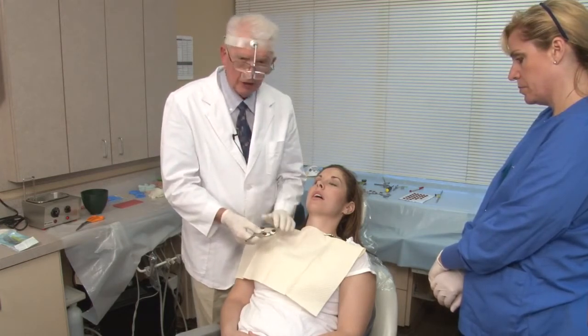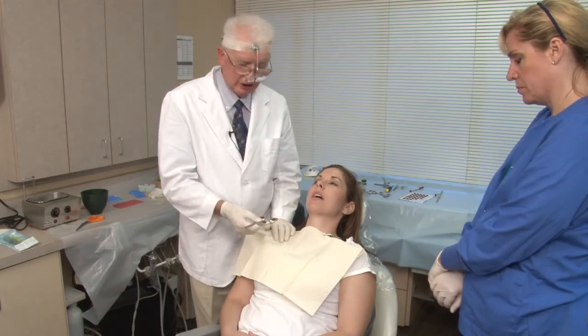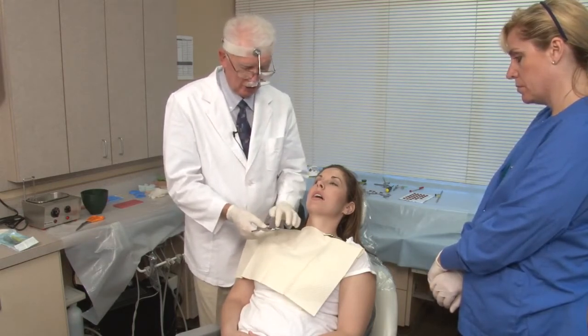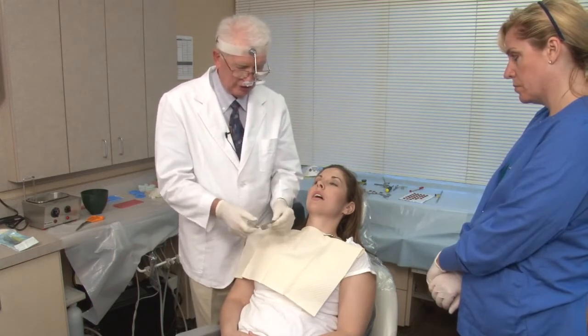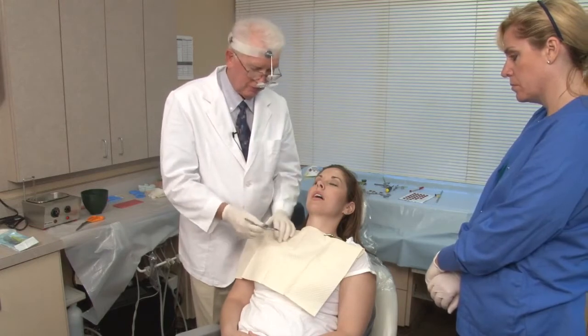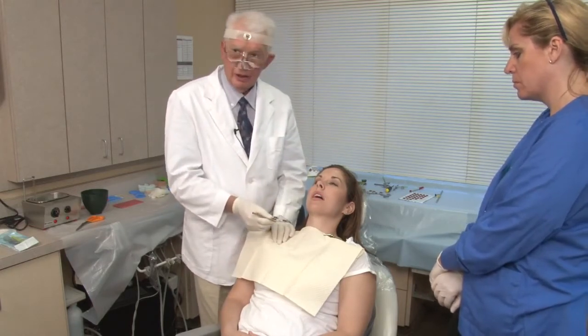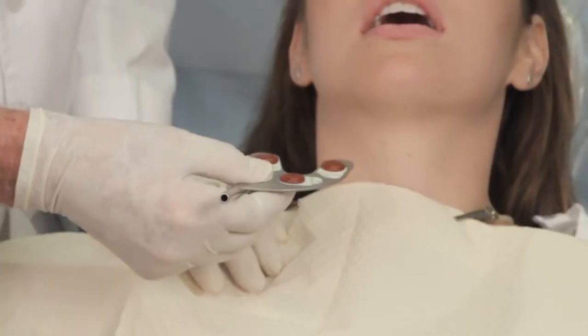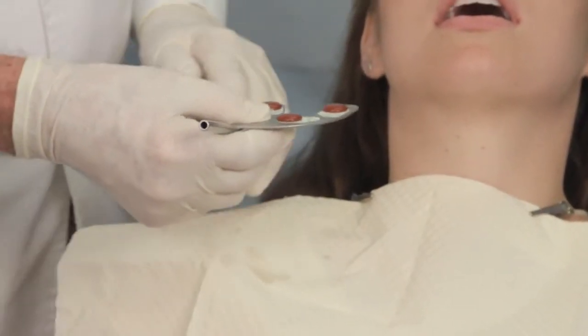If they touch the metal, you have to do it again. Teeth only touch the compound. You cannot touch the metal with the teeth. That's another reason why I like to set the base of the compound to prevent me from overseating the bite fork and teeth hitting the metal then. So that's the procedure that I'll follow.